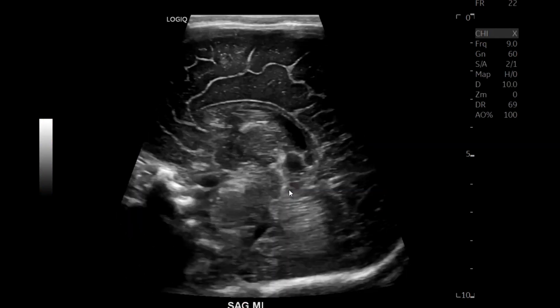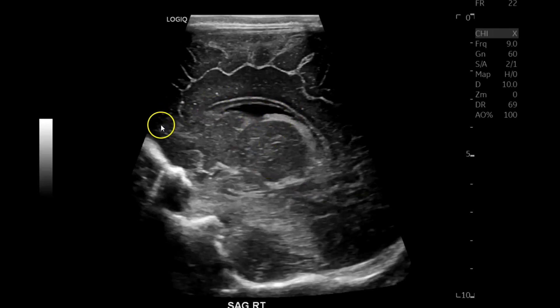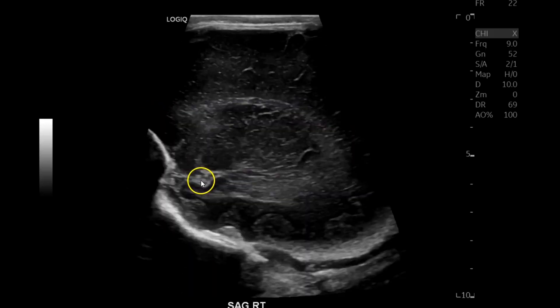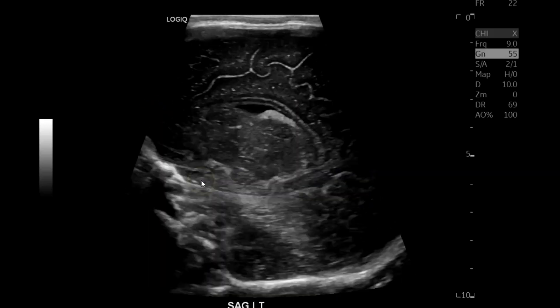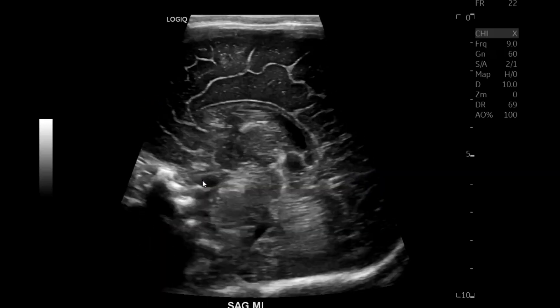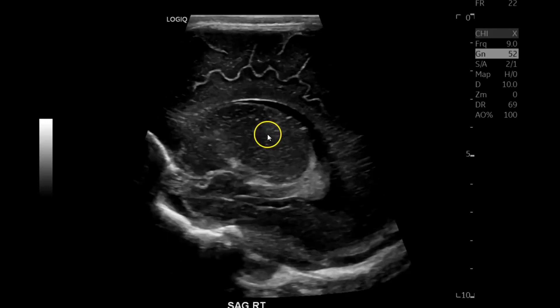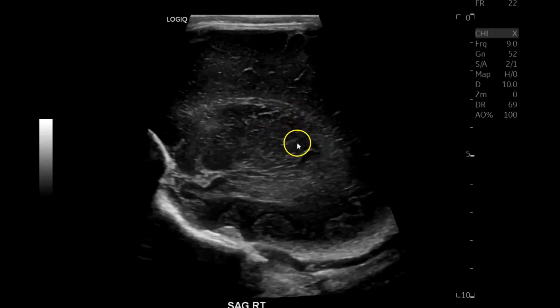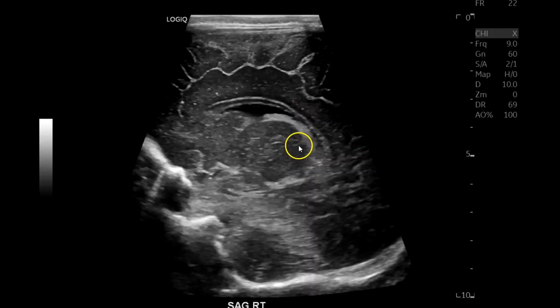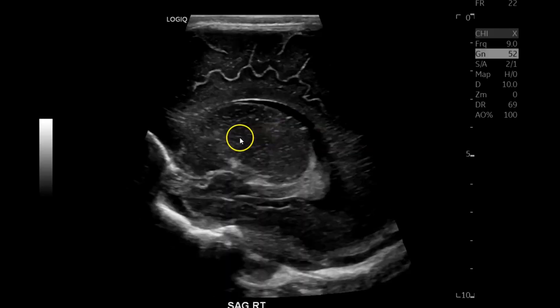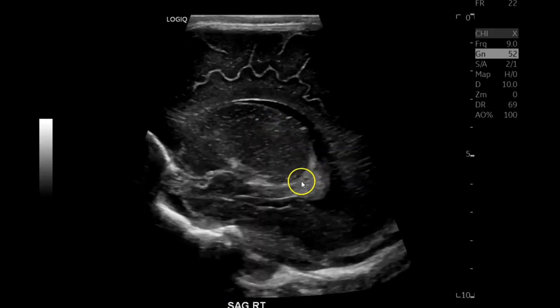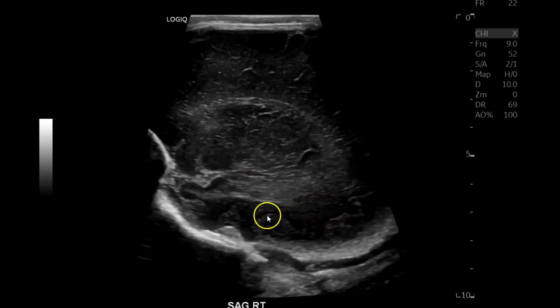Just beautiful — very comparable to the LOGIQ 9. Then with the linear probe I take more parasagittal images: caudal thalamic groove, thalamus, caudate nucleus. More lateral, you have more choroid plexus and the occipital horn of the lateral ventricle.